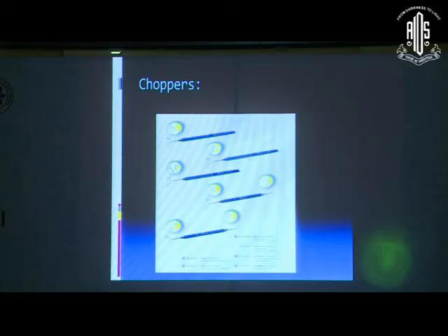Then you will be using choppers. This is not a machine but an instrument for your left hand. You have to be ambidextrous for this surgery. You can have a single-end chopper or the David Chang chopper, which has a sharp tip and a blunt tip at both ends. Choppers can be personalized. You can have a 0.75 length, you can have 1.25.